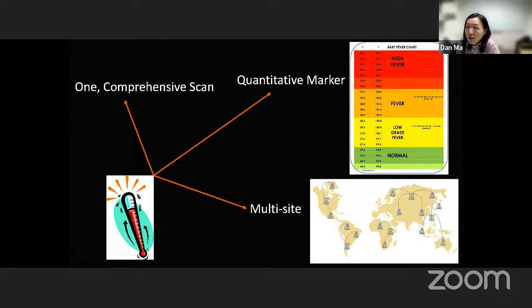That study was performed at 3T. I also remember another study published estimating the reproducibility at 1.5T. So I guess people have been doing reproducibility studies at different field strengths, mainly 3T or 1.5T.